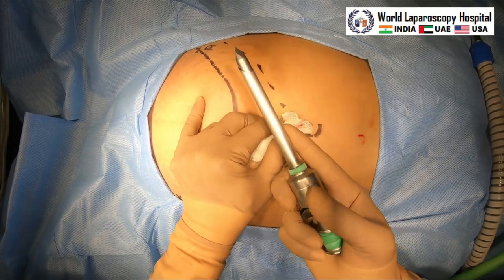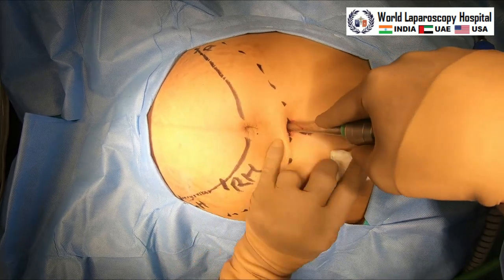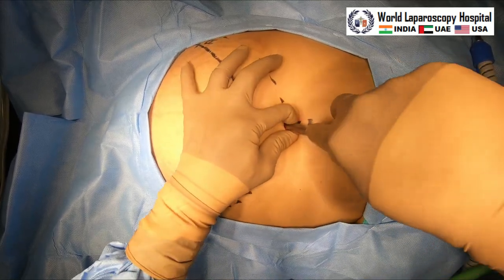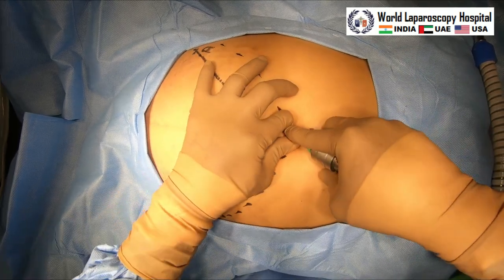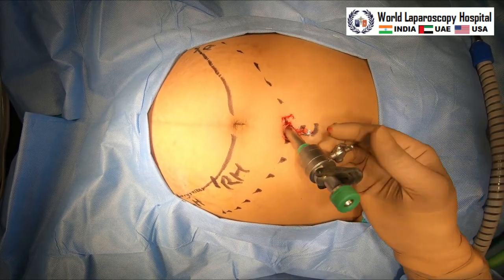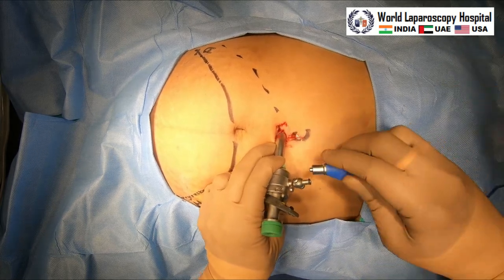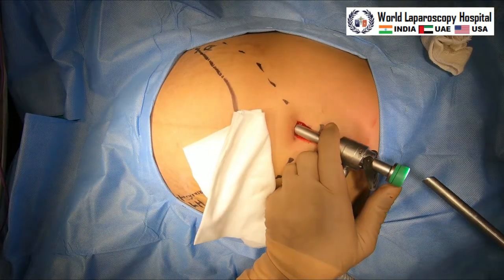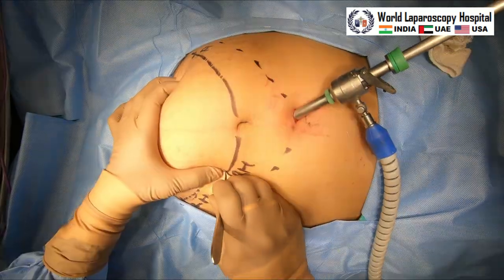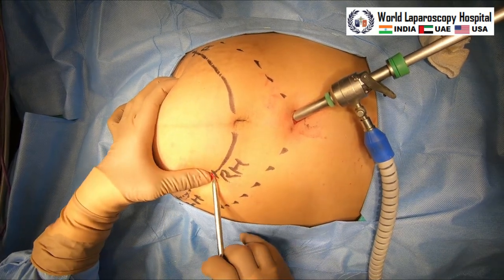Then the optical port, that is the 10 mm port, is introduced. Hissing sound. Gas is attached. Telescope is introduced. Under vision, the working port will be introduced.